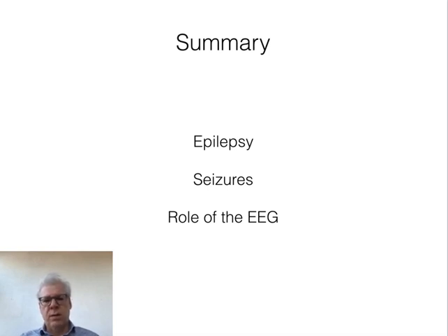Of course, if a patient comes to the physician, we don't only make EEGs. In most cases, we will also do, of course, an MRI scan or a CT scan of the brain, and of course, very carefully history taking and neurological examination. But the EEG is a very important component of the diagnostic strategy in epilepsy.